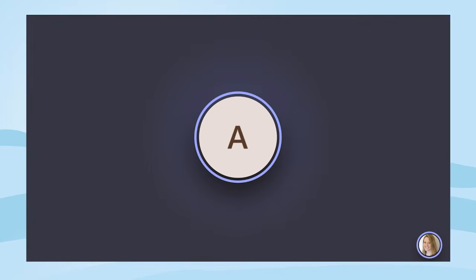So the first question that we had was from Chris, who said, in your experience, how long does it take a person with ALS to get proficiency with the core board? Oh, yeah. Well, I find it's pretty fast, actually, because once they get the concept of what kinds of words are on the core board, and the words on a core vocabulary board are going to be the words that we use over and over again in sentences, so not nouns.